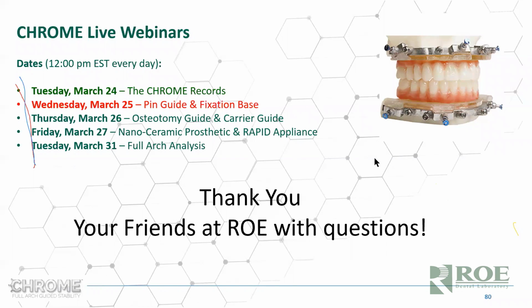But if it is extensive, as in the flipper is half the teeth in the mouth and the bite depends on it, and it has some substance, right? It's pretty thick. I'm kind of giving you not a very good answer on the thickness of it. 2, 3 millimeters thick, has some substance, then yes, you can use that as a dual scan prosthetic. But again, if it's not holding the bite open, then just use regular dentate records.